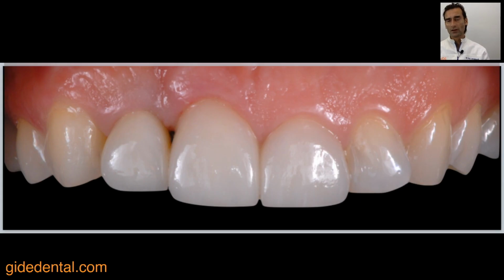We discussed with her that probably the easiest way to control this for her would be to lengthen tooth number 9, so the healthy central incisor, and to do some surgical crown lengthening for her after the healing of the implant. Tooth number 7, where she has an existing implant, looks very good, especially if you think about plus 10 years. Maybe a little bit thin on the gingiva, but at this moment, we could probably increase the thickness on this tooth by adding some soft tissue at the time of implant placement.